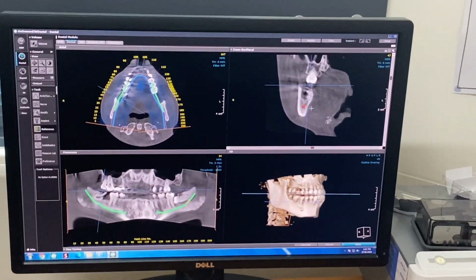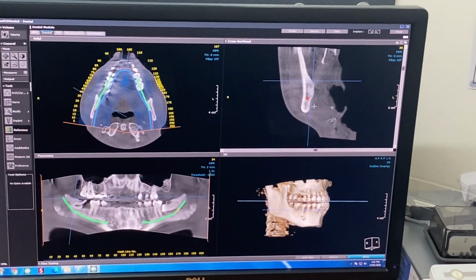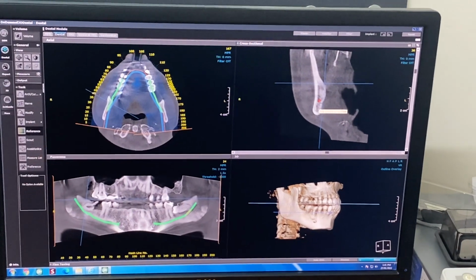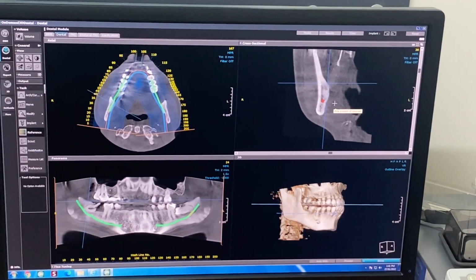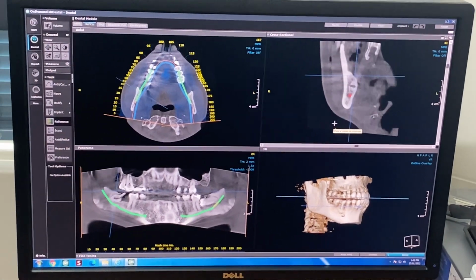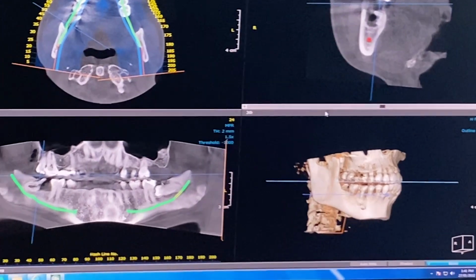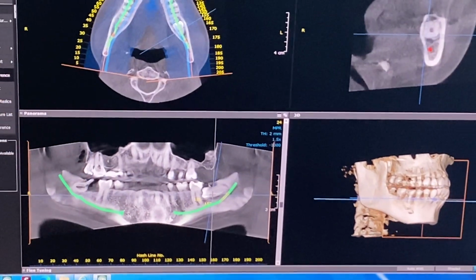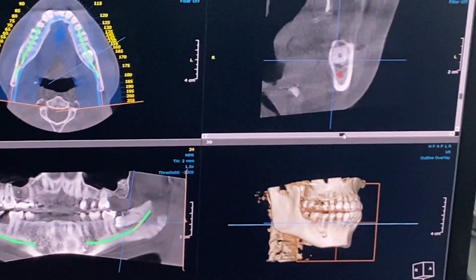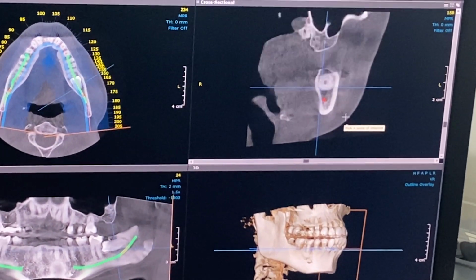I'm just going towards the apex of the tooth now, and even though it's fairly close to the nerve, I know exactly where I am. I can actually take measurements. And whilst we're here, we're going to take out 1/8 as well, because it's decayed. Coming straight across to this 3/8. Wow. And we're doing this in theatre.